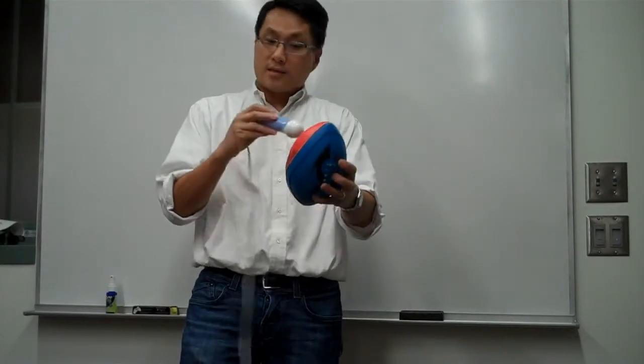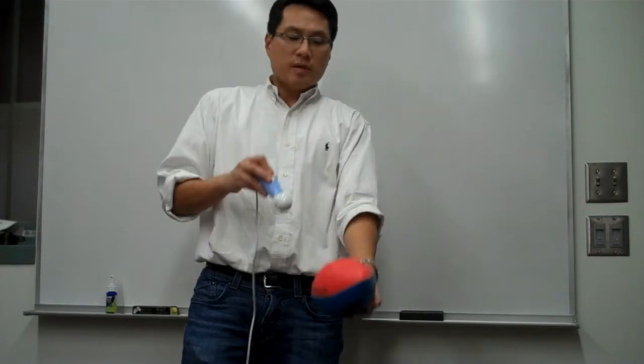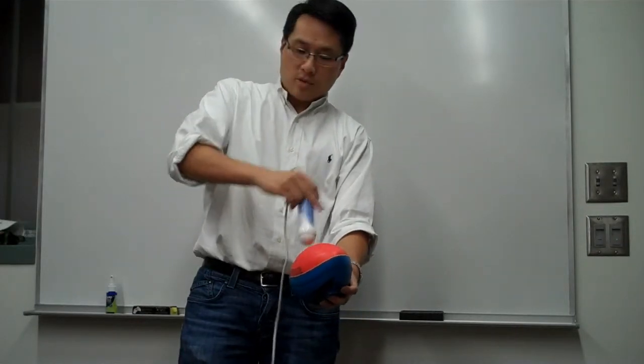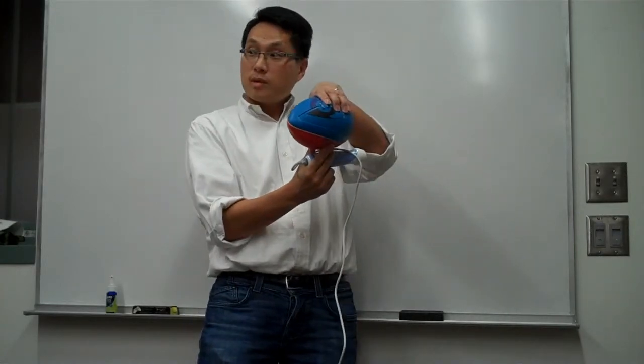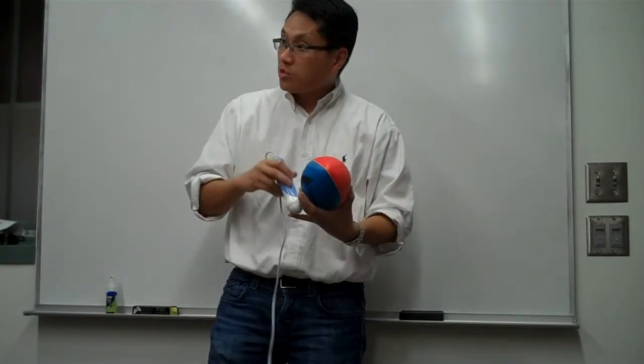Now, exactly the same position. I don't move this at all. Just imagine this is inside the mother, right? I just turn this 90 degrees, so I'm cutting this way. So you turn it this way, and it's not an oval, but a circle. That's the fundamental problem that we want to show.